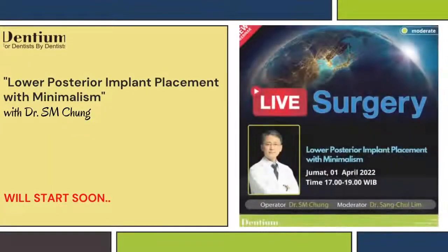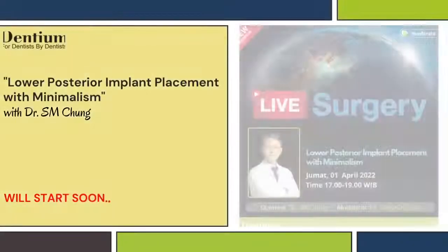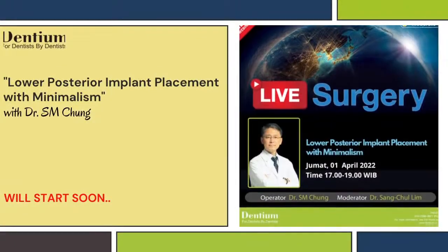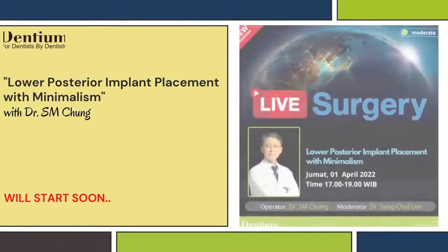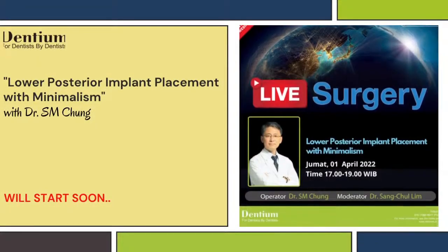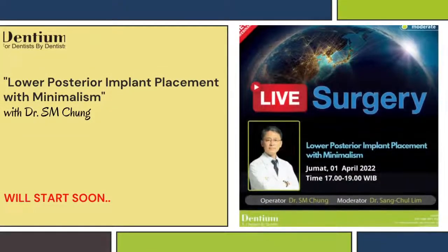So sometimes we can choose a simple way like this instead of fully augmented treatment with GBR or some other complex procedure. Sometimes simpler procedures are better for the patient. So the final restoration looks like this: just slim, small diameter implants inserted for the final restoration due to the narrowed ridge, right?